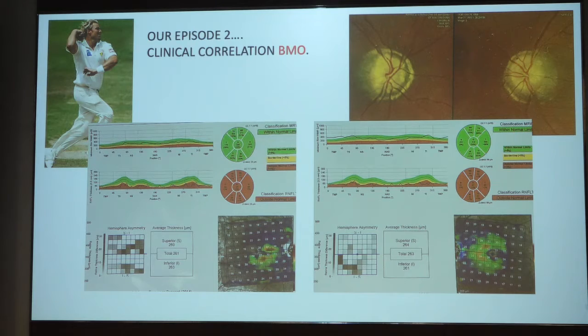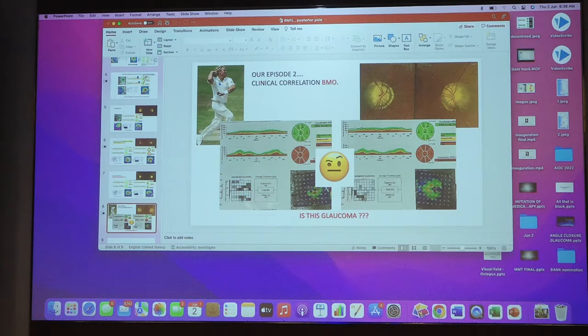Now, this is the last example, the great Shane Warne, the bowler of the googly. So I just continued with the last MRW example. You want me to show you again the MRW? In this case, I'll just go back to the last PPT, and then you can put this in perspective.